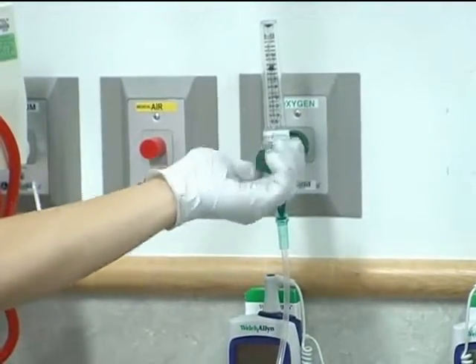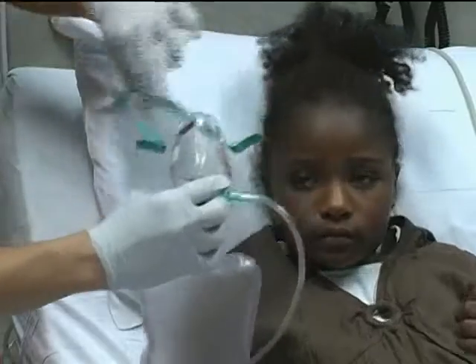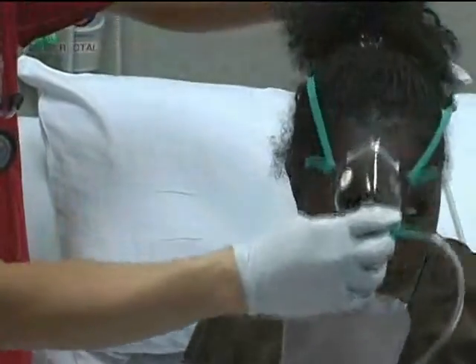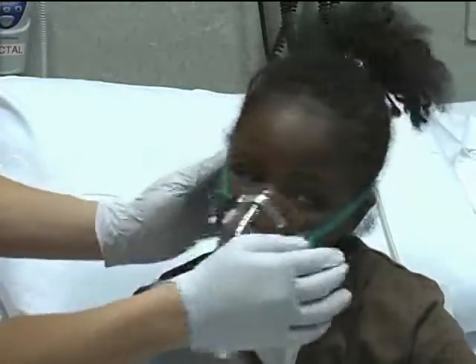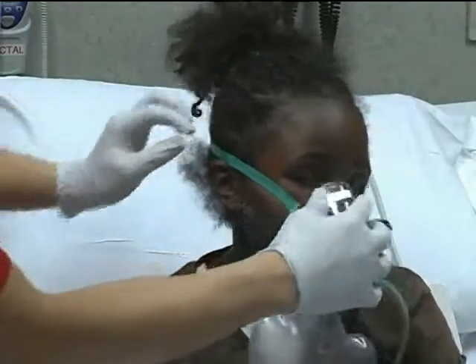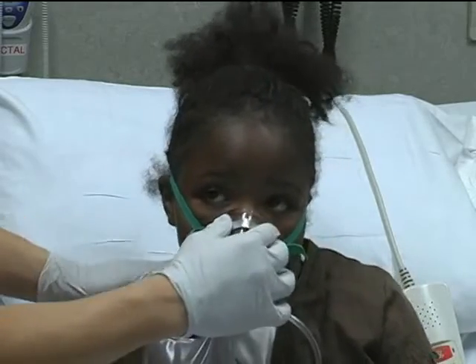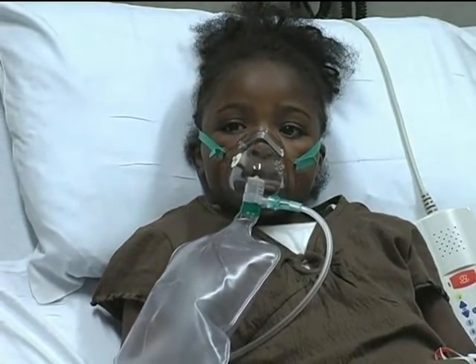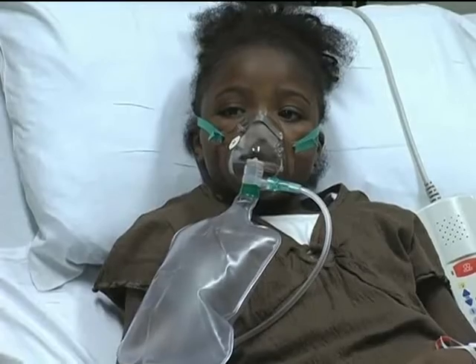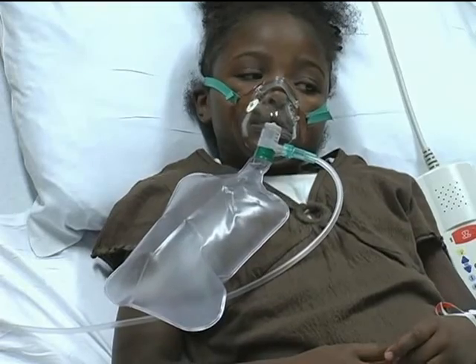Flow should also be a minimum of 10 to 12 liters per minute to properly fill the reservoir bag and prevent collapse of the bag during inspiration. A non-rebreather face mask is fitted in the same manner as a simple face mask. Fit the strap around the skull and use adjustable straps to fit the mask around the nares and mouth without obstructing the eyes or having the mask hang over the chin or jawline. The reservoir bag should be inflated and not collapse when the patient inspires. When fitted and connected properly, full non-rebreather masks can deliver oxygen concentrations of greater than 95%.